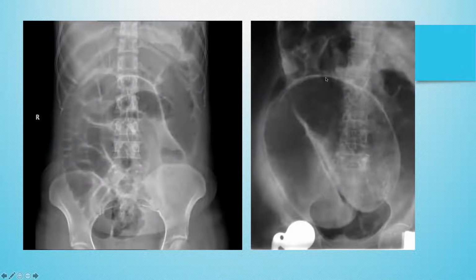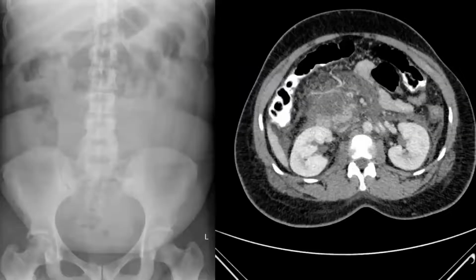Garvin Seaman. What do you think is going on here? So there's a dilated loop of large bowel, looks like a volvulus. Yeah, it is a sigmoid volvulus. Well done. Straight to the point. So this is another case of, actually, we'd call this a localized ileus or so-called sentinel loop.